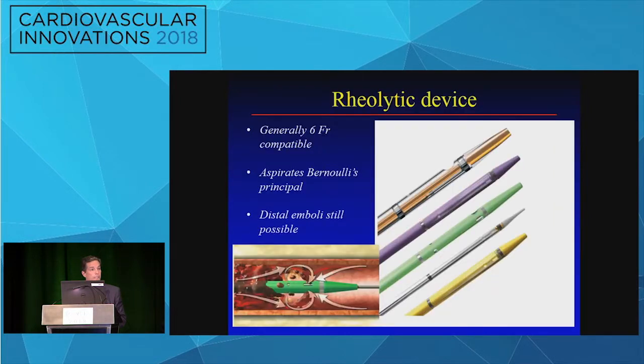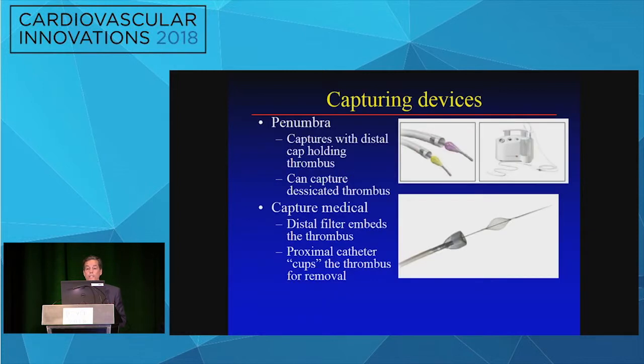There is a need for rheolytic thrombectomy. There's still power pulse spray. The only way that Angiojet has maintained its position in this world is in the periphery after the AMI trial fell flat in the coronaries. And it's a pretty good device. They now have a myriad of devices, small, medium, and large, to get you there.